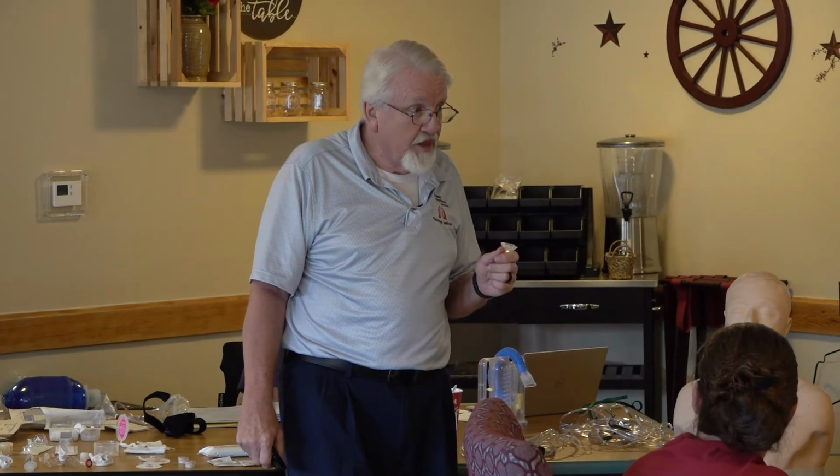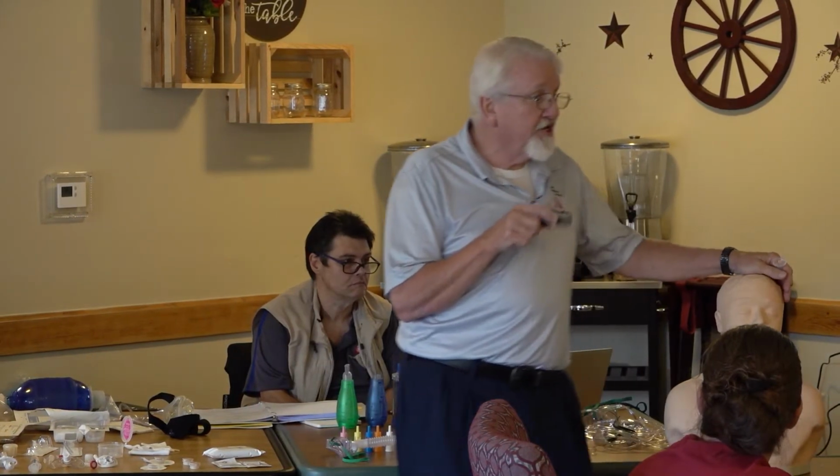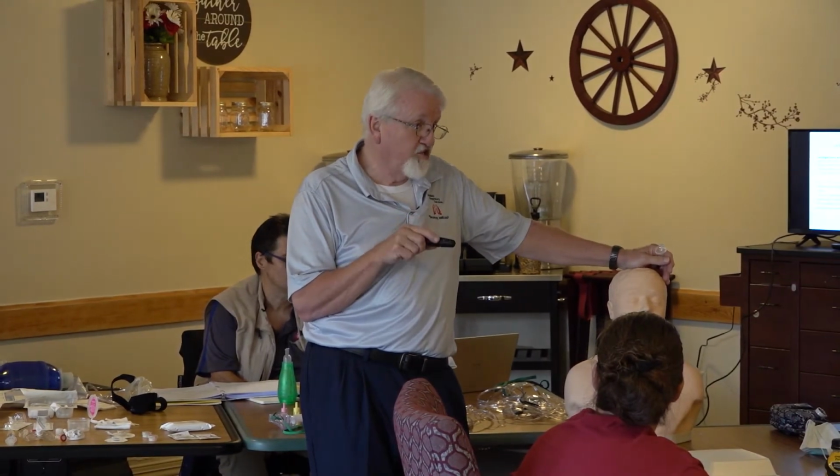Do they ever use stitches on these? On which? The trachs. Trachs. When a trach has been initially placed, it's going to have anywhere from 4 to 8 sutures.